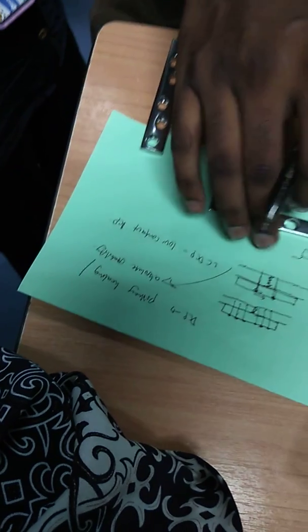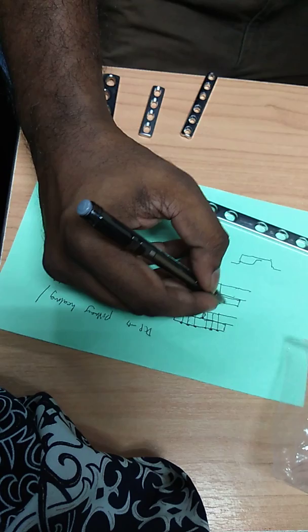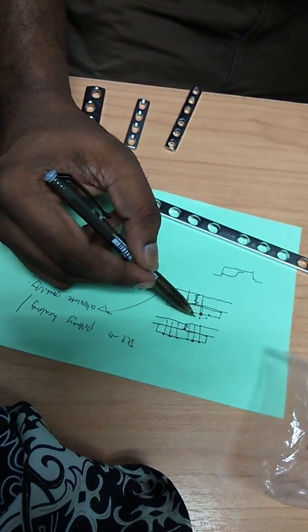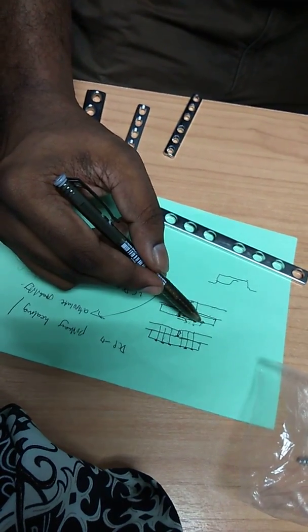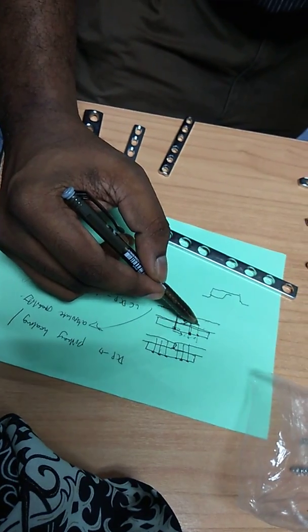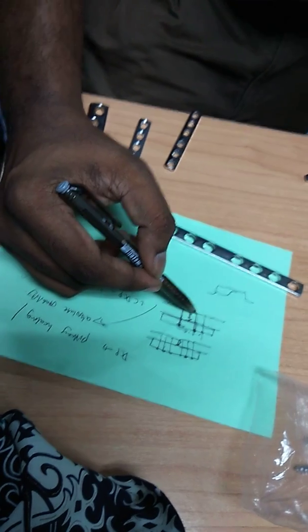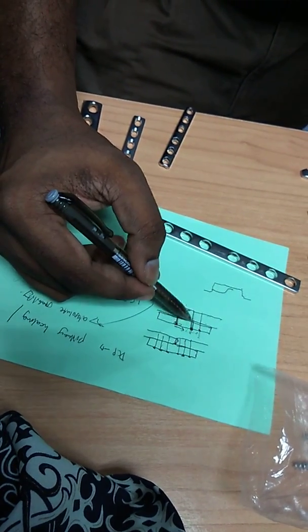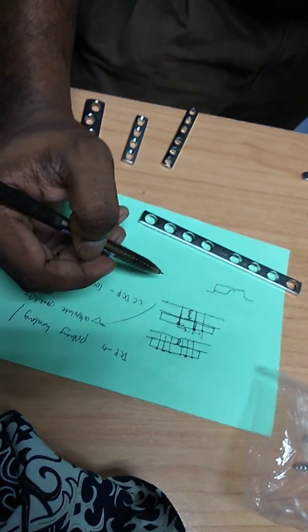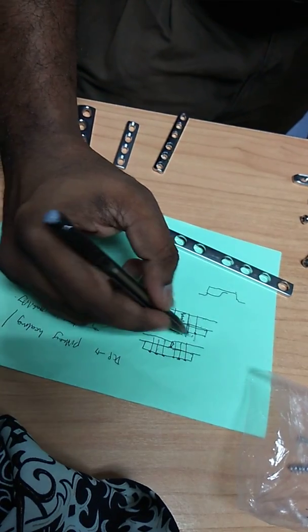So this compression screw, once you already put on one side, you can put one more on the other side of this hole, just to compress from this direction, so there's more compression at the fracture site. Once you've drilled, you put the screw halfway, then release the screw halfway, then you put the other screw through, and only then put back the first screw, because this screw here will hinder the compression effect from this screw which is placed eccentrically. Understood? So compression can be done from one side or both sides also.